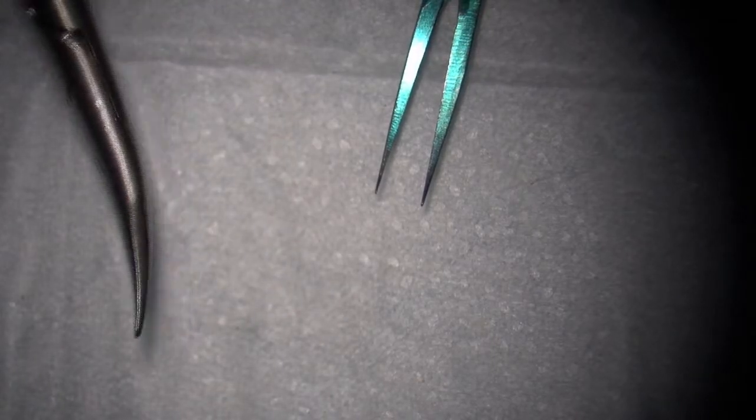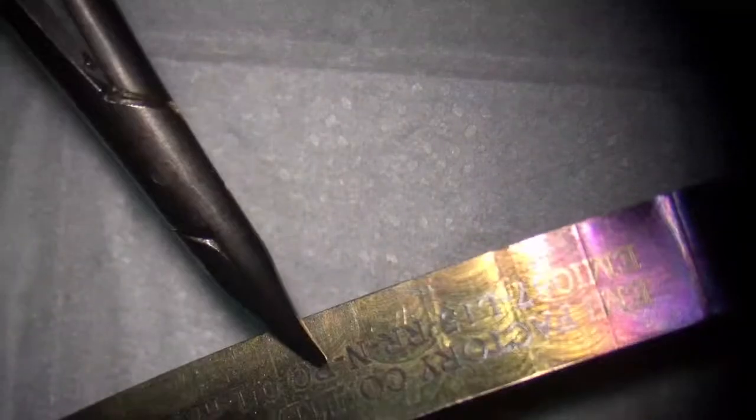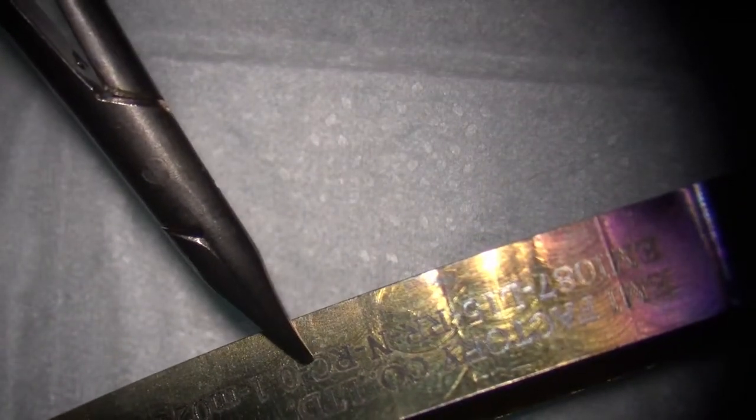Now I will tell you guys about the regular set. This is the regular microsurgery instrument in plastic surgery. Regular means one thing: the tip is 0.3 millimeter. Like this one, here's a number, 0.1 millimeter. This is from the company EM, a round handle curved needle holder, and 0.1 is the size of the tip.